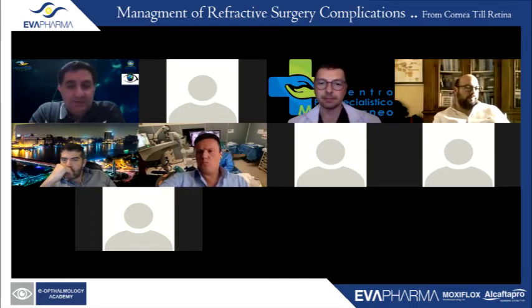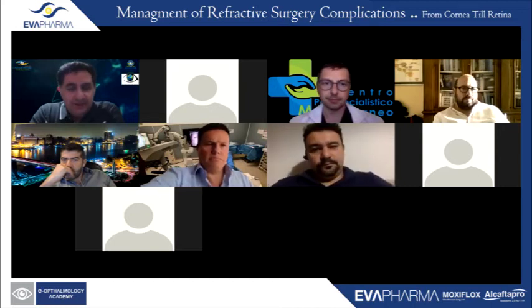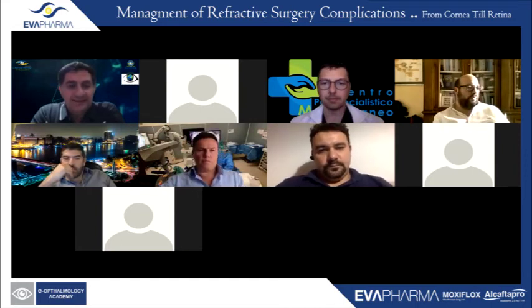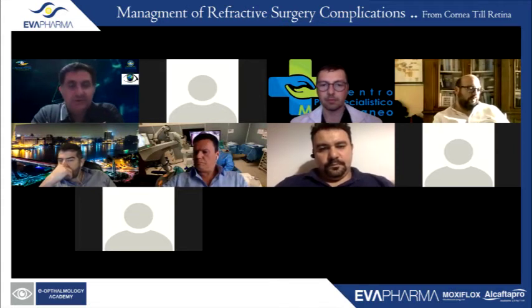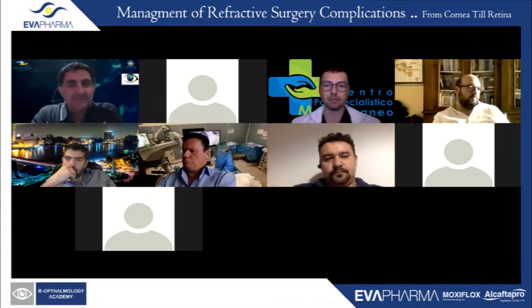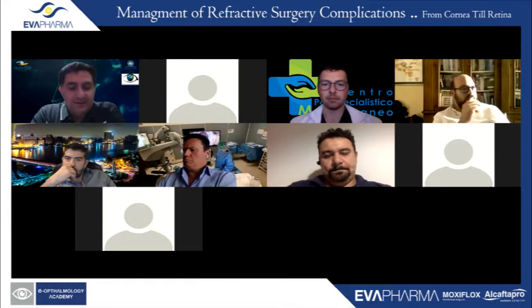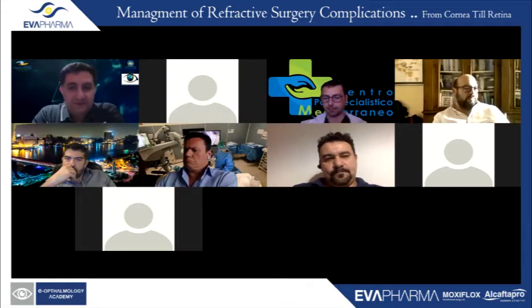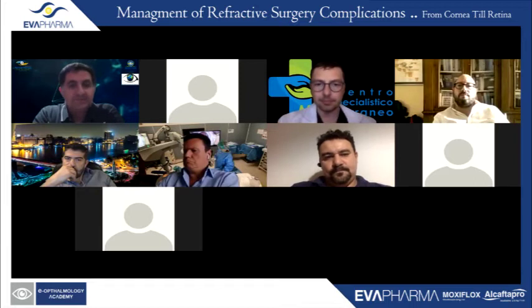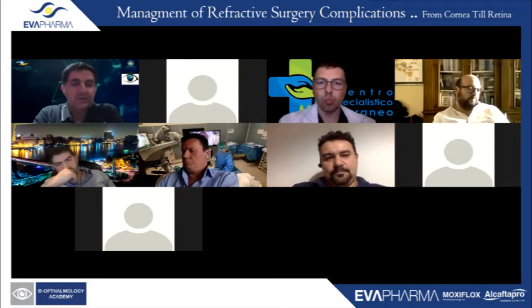For me, I stopped the microkeratome since 2015. I didn't do any case from 2015 till now, except one case only, because I feel that the safety measures given by femto LASIK are worth more than any cost the patient will pay, because the complications of the microkeratome, if they happen, can lead to disasters in a patient. He's seeing well, perfect with glasses or contact lens, and he's seeking the same results with refractive surgery.